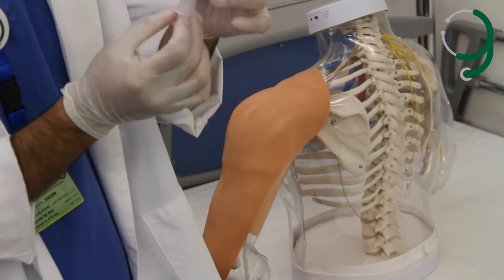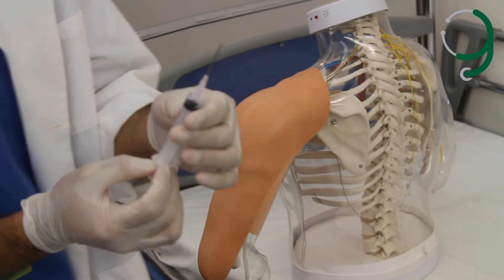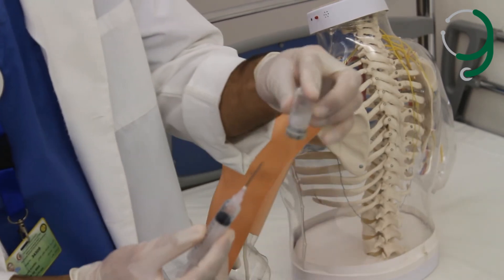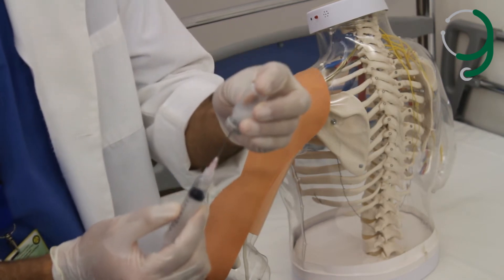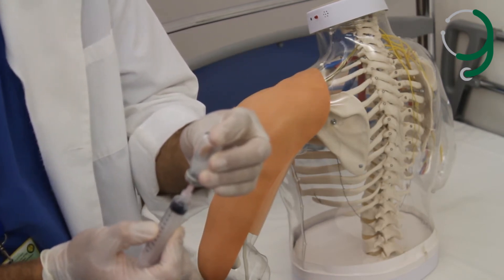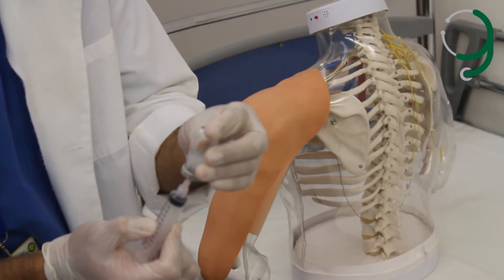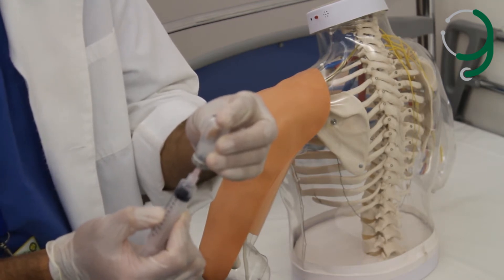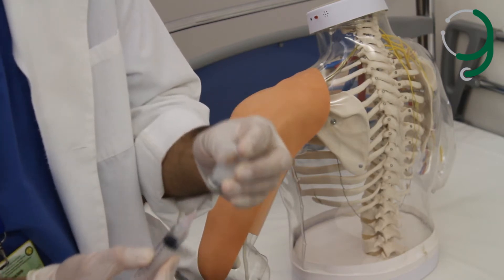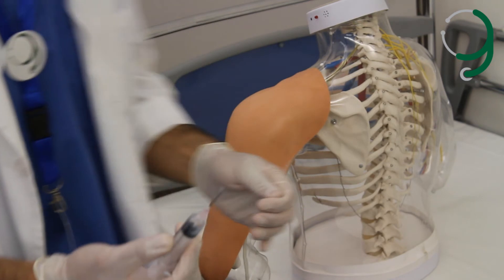We let it dry. Then we aspirate air into the syringe for the same amount we need to inject. This is the vial — we inject the air inside, then we draw back the same amount we injected as air.